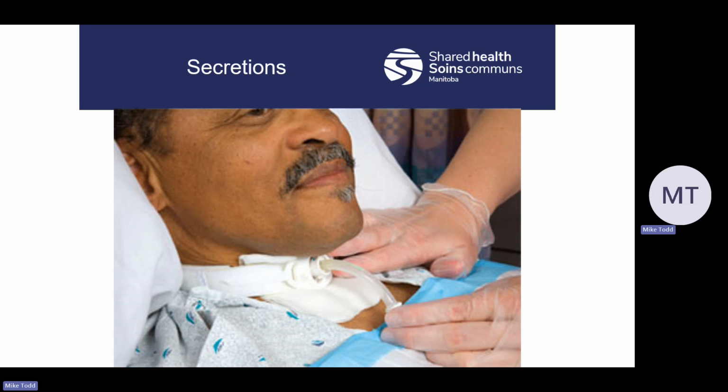The big thing you have to be careful of is to not pull the outside trach device out. So we want to hold the neck plate with one hand, like you see in the picture here. With the other hand, unlock the inner tube. Again, just gently rotate it and then remove the inner cannula. If you have trouble removing that inner cannula, don't force it. Just look at other options. Suction might be your next option for these patients. And please, please, please be very careful not to remove the outer cannula. That's what's inserted into their throat.